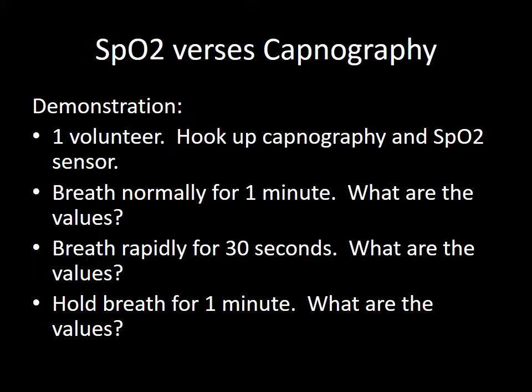So it's a really good tool for monitoring a patient who's sedated or altered mental status, who you're worried might stop breathing. Put them on capnography. If you just have them on SpO2 and you do see a decrease in the SpO2, that means it's been several minutes that they haven't been breathing adequately.